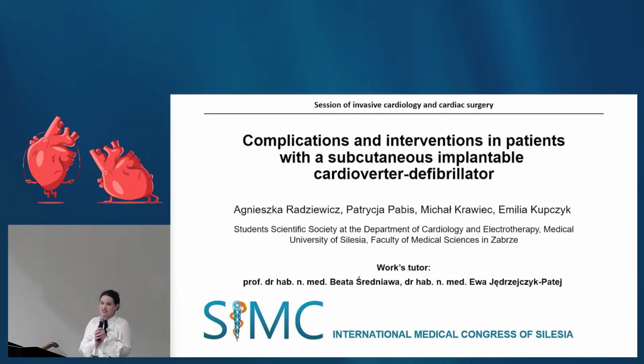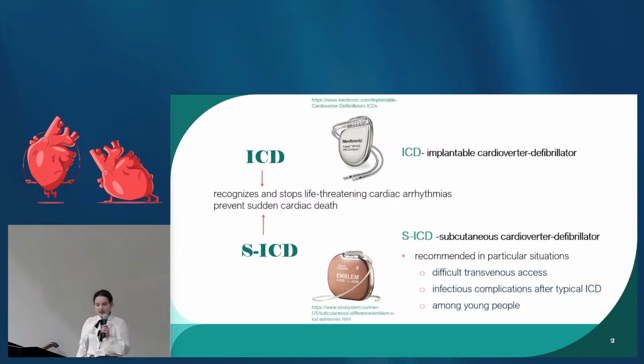Dear jury, my name is Agnieszka Radziewicz, and I have the pleasure to present you a lecture on the topic: Complications and Intervention in Patients with a Subcutaneous Implantable Cardioverter Defibrillator. At the outset of my presentation, I will explain what ICD and SICD are. Both devices are designed to recognize and stop life-threatening cardiac arrhythmias, thanks to which they prevent sudden cardiac death.